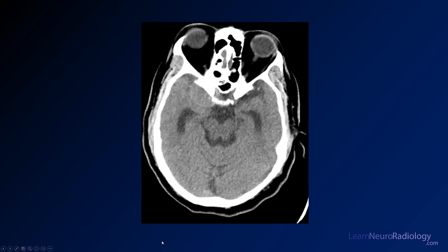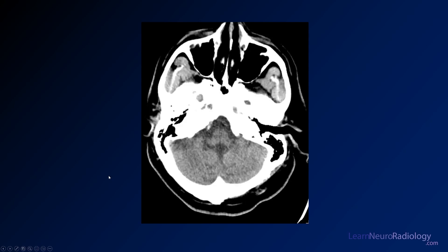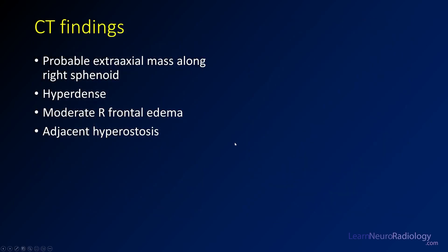We see there's probably a mass that looks almost like it's centered around the bone or an extra-axial space. On the bone window, is there a little bit of hyperostosis? Maybe — but this is really hard to see. We just see some mass effect and surrounding edema, so you're definitely going to need an MRI in this patient. We think there's probably an extra-axial mass along the right sphenoid — it does look a little dense, and there is right frontal edema. Our differential is really a meningioma, as it is by far the most common extra-axial tumor.